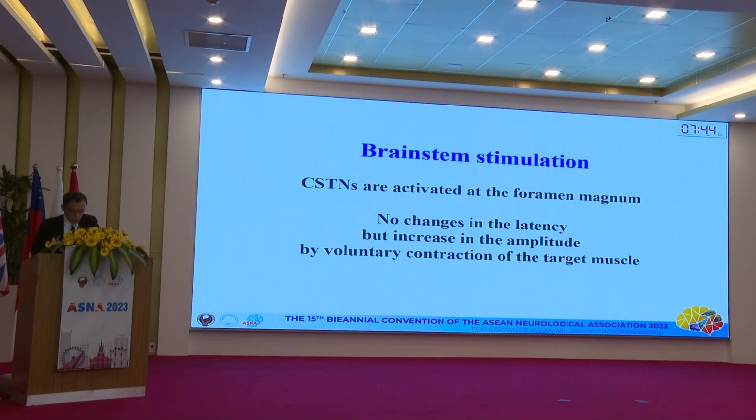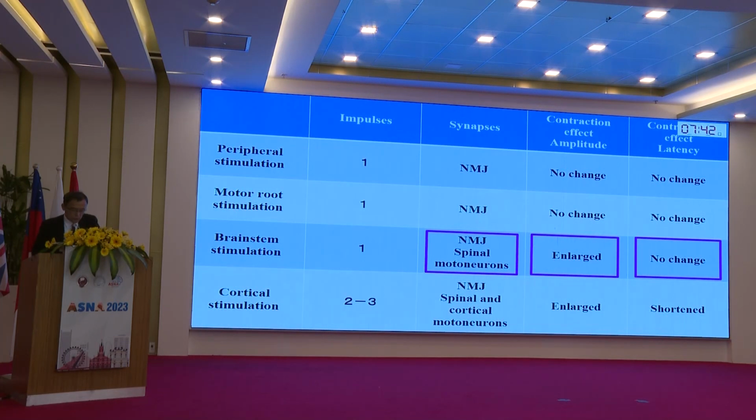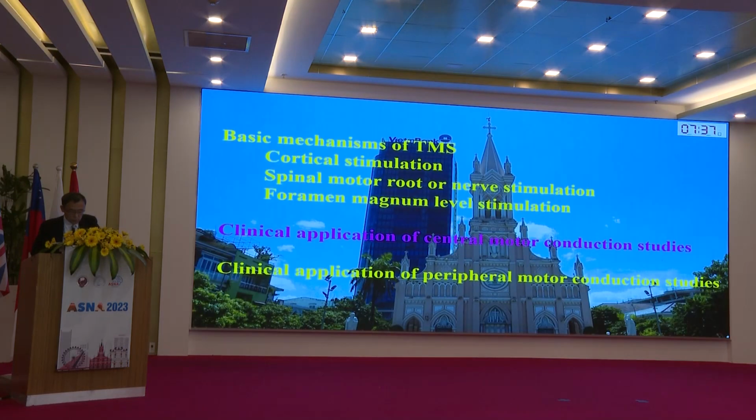So anyway, that's another stimulation point we could use. Because of the only one additional synapse, there is enlargement and no latency change. Now, the clinical application of these methods.